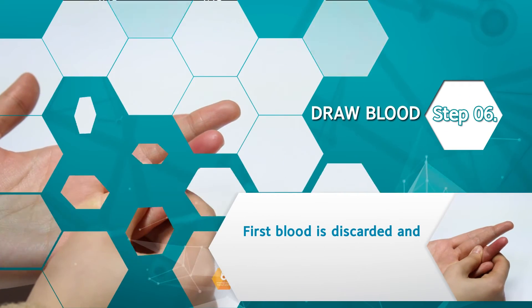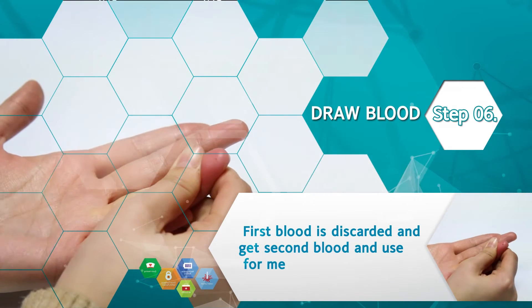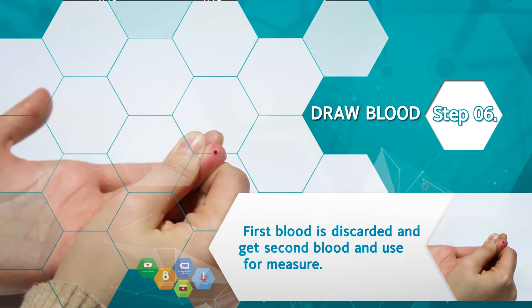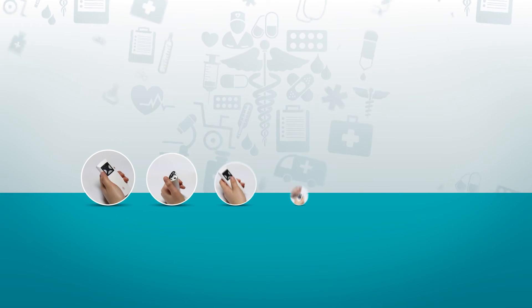Step 6: wait 2 to 3 seconds and squeeze the finger smoothly — you can get the blood. Then take the test. Thank you.